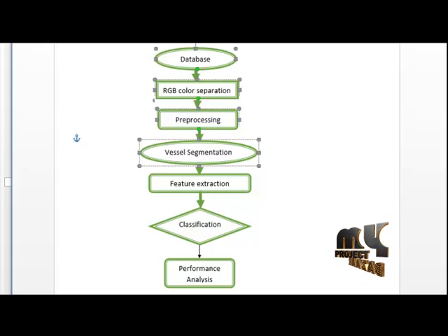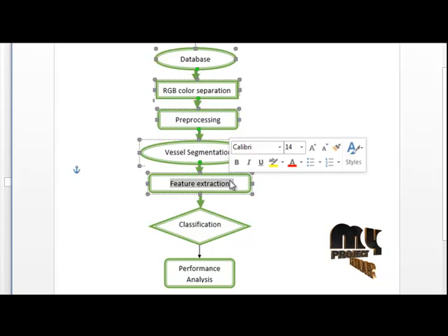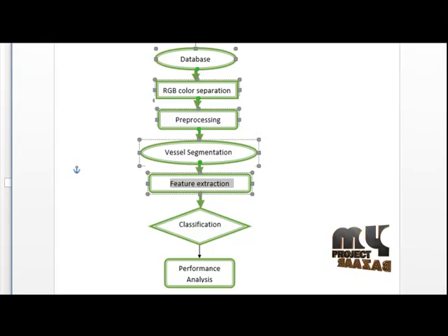Then the next method is the feature extraction. For feature extraction, here we use the shape feature extraction method. For shape, we consider two methods. The first one is the moment invariant feature extraction. It's a function of image moments. Moments are the projection of the image function into a polynomial basis. Moment invariants have been frequently used as features for image processing, remote sensing, shape recognition and classification. Moments can provide characteristics of an object that uniquely represent its shape.